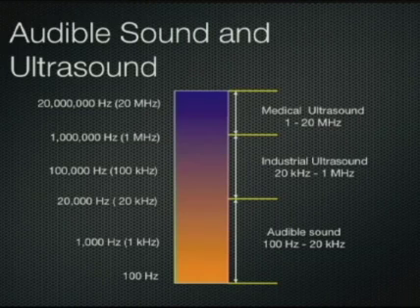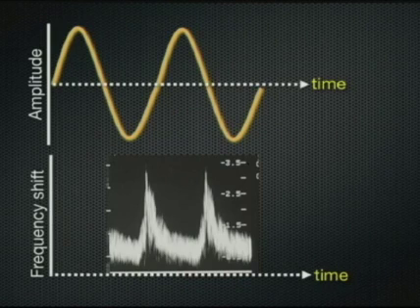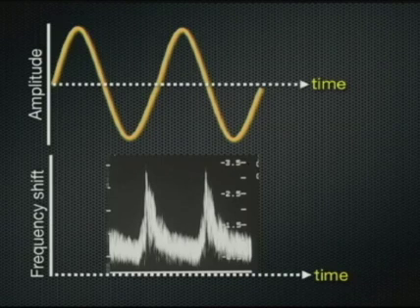Now, although audible analysis was used in the very early days of ultrasound, modern ultrasound devices provide a display of the Doppler spectrum. I'd like to comment for a moment about how we go from the measurement of the Doppler frequency into the typical Doppler frequency spectrum display shown at the bottom of this image.